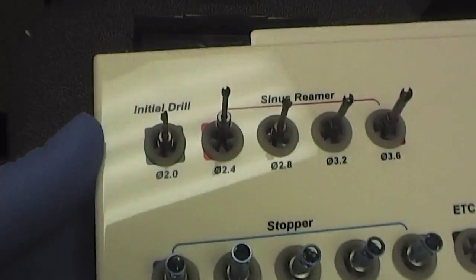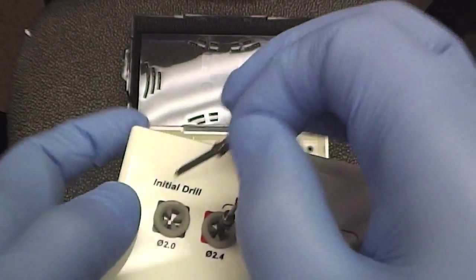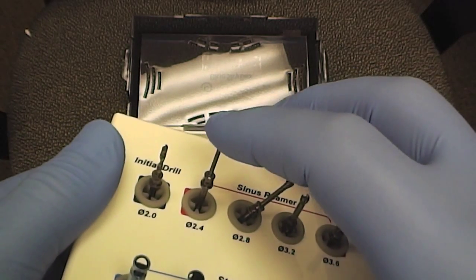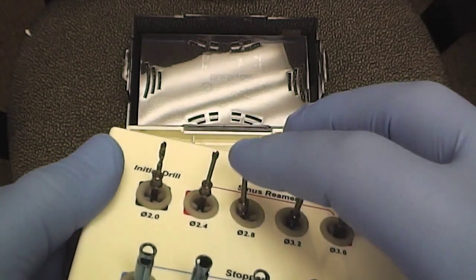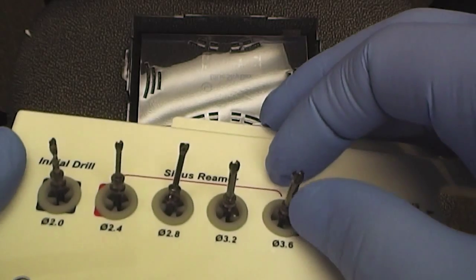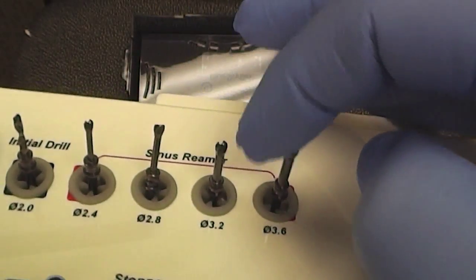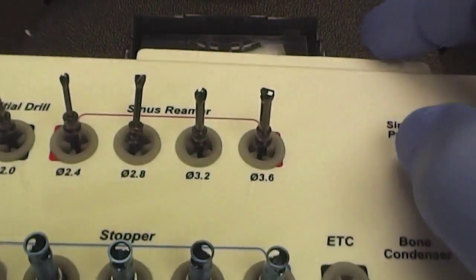You'll notice that there is a 2 millimeter initial osteotomy burr. This little flange here is the area that catches the stops, as well as a 2.4 millimeter safe-sided osteotomy extender, a 2.8 millimeter safe-sided osteotomy extender, a 3.2 millimeter safe-sided osteotomy extender, and a 3.6 millimeter safe-sided osteotomy extender. These safe-sided osteotomy extenders work by creating a little plug of bone at the top so you can't really perforate the sinus.